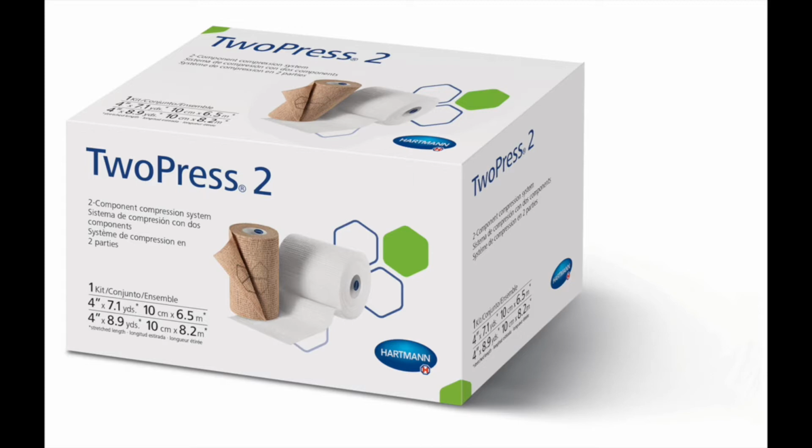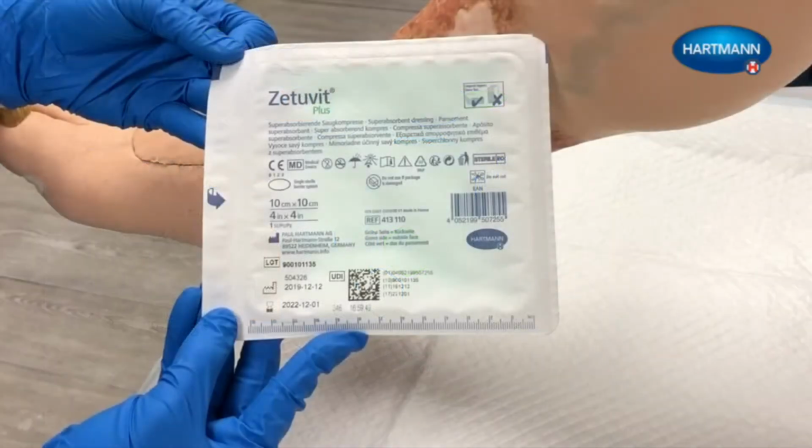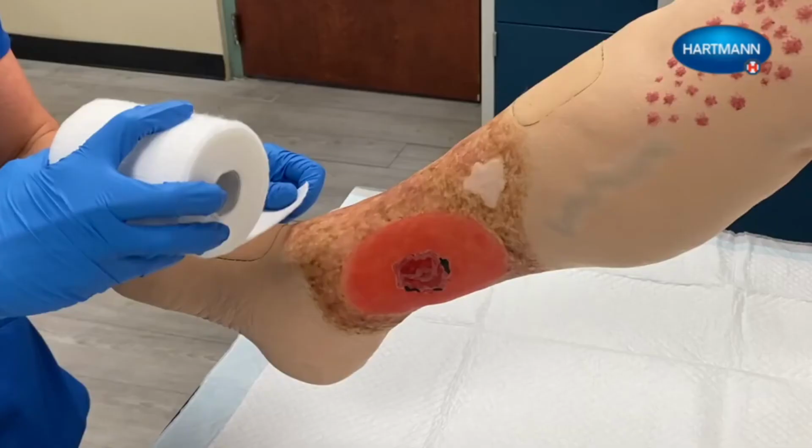Before applying TwoPress 2, clean the wound and cover it with a suitable wound dressing. In this example, we are applying Zetuvit Plus super absorbent dressing as our primary dressing. Next, examine the leg before application to identify bony prominences and potential pressure points, and pad them with a padding bandage. Please use the system as a set and in the correct order.